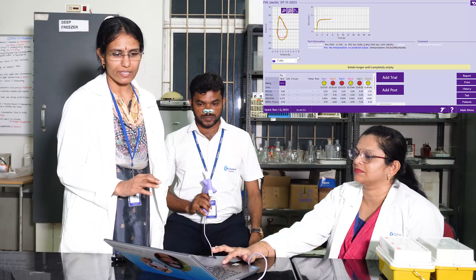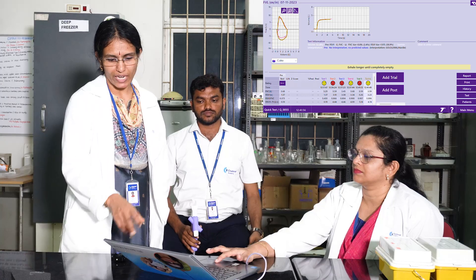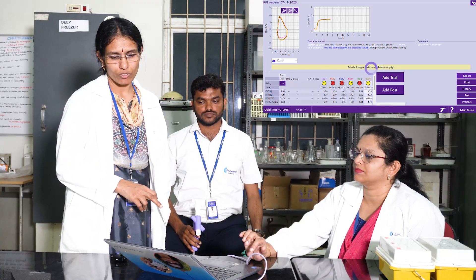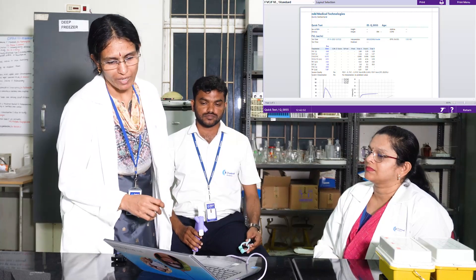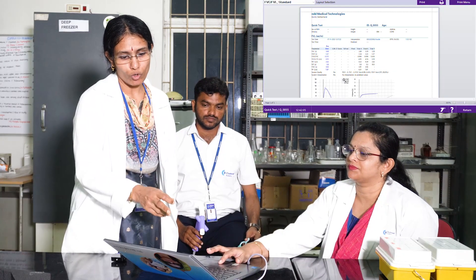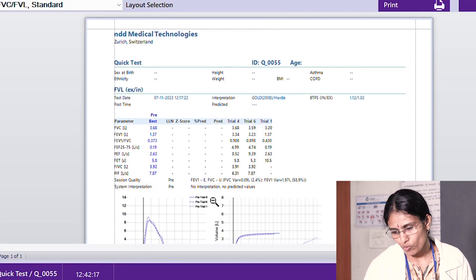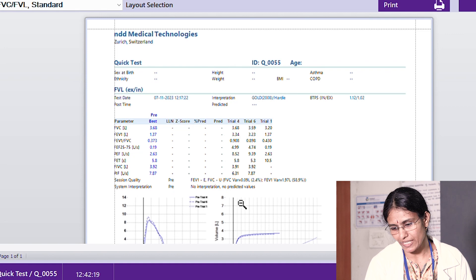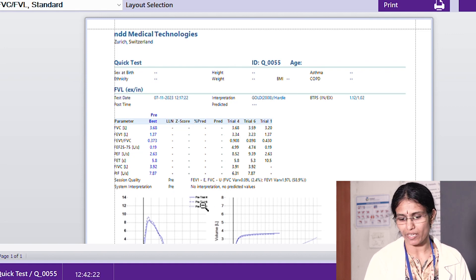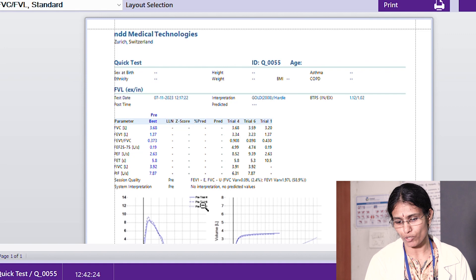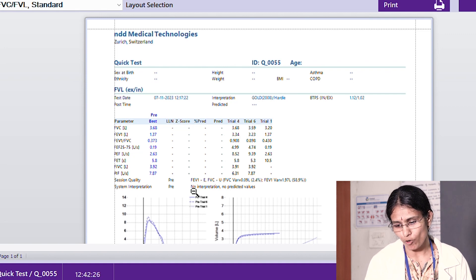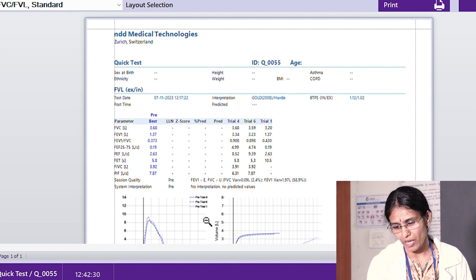You can do three trials and the best of the three can be taken, after which the report can be generated. This is the report. From the report, these are the values which can be interpreted. The forced vital capacity is 3.68 — that is the maximum volume of air expired during this manoeuvre. The forced expiratory volume in one second, the ratio, and the average mid-maximal flow can also be interpreted.